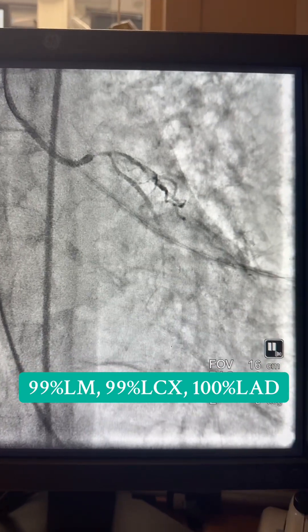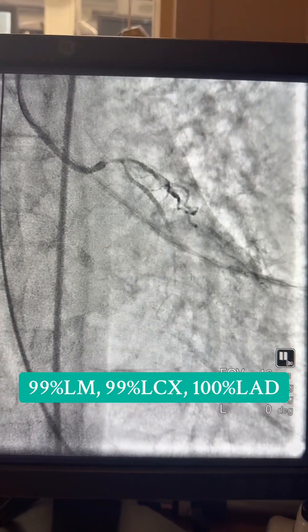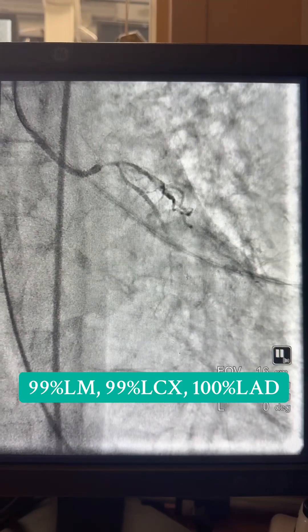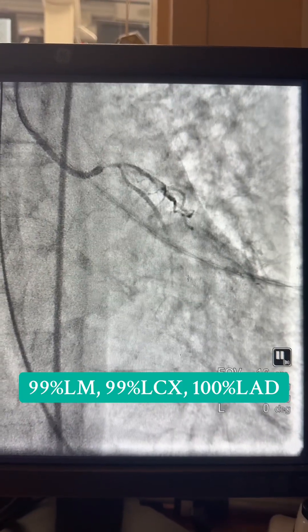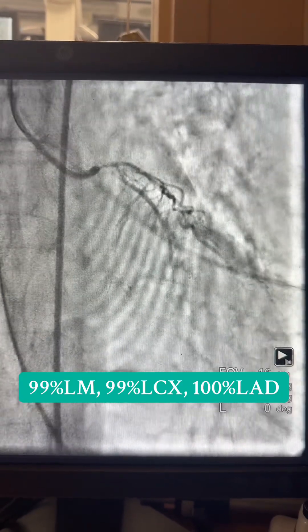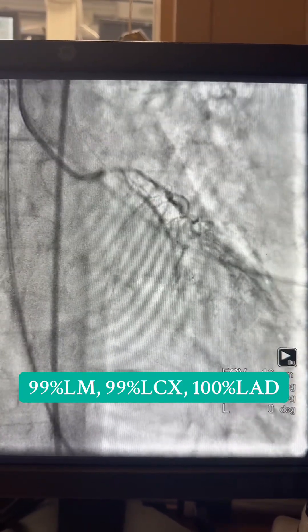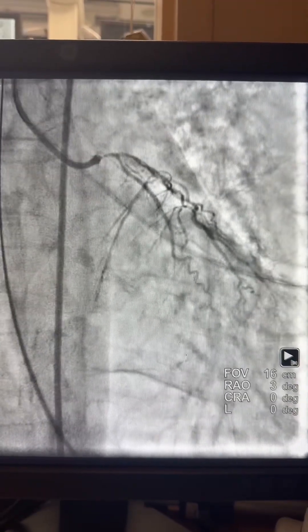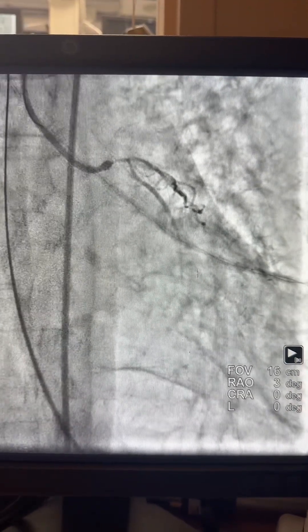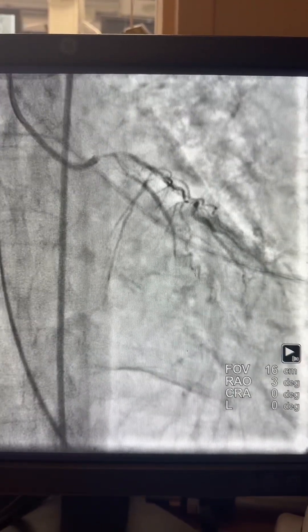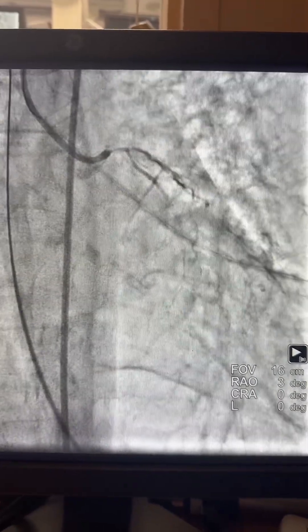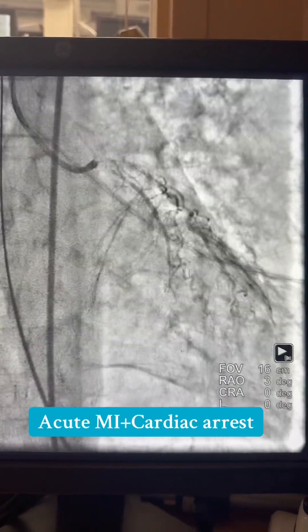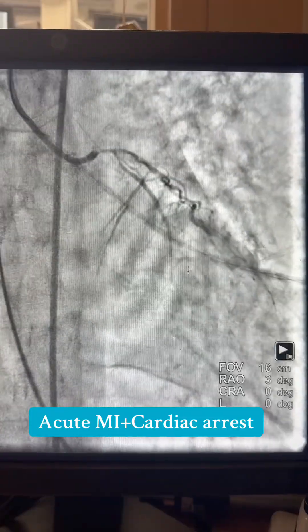Hi, this is Dr. Hamel, and today I'm sharing with you this complex acute MI case with cardiopulmonary arrest. The patient is 75 years old, presented with acute MI, she had PEA, CPR was started, she was intubated, and then brought to the cath lab while doing CPR.